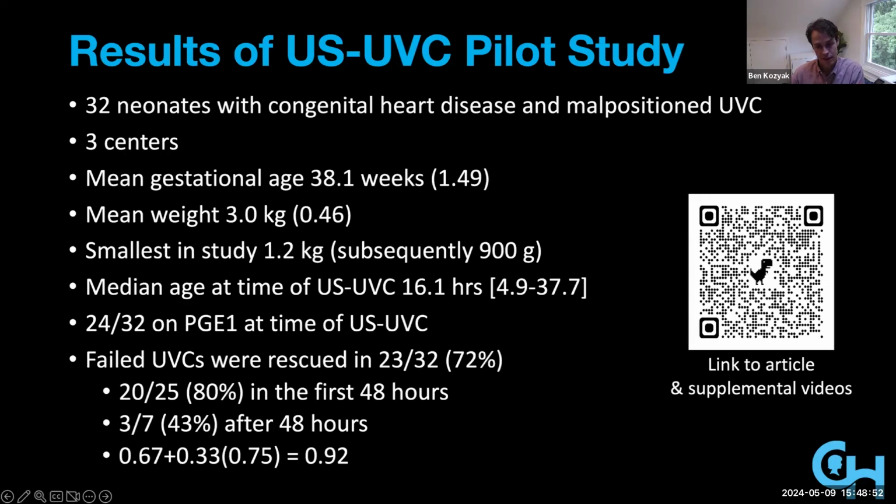What was interesting to me about that is that those are almost exactly the same numbers that we saw when we made ultrasound the standard of care for percutaneous central lines and percutaneous art lines in pediatrics. So that was exciting to us, and we've continued to do this. We've done a bunch of patients. I did 3 or so in the last couple of weeks, both myself and with people who are relative novices, and the learning curve is not that hard. Sometimes they're frustrating, sometimes they take a while, sometimes they're quick and super satisfying. But it's a procedure that has gained traction in our unit, and I think others in the neonatal world and CICU world are starting to employ it as well.